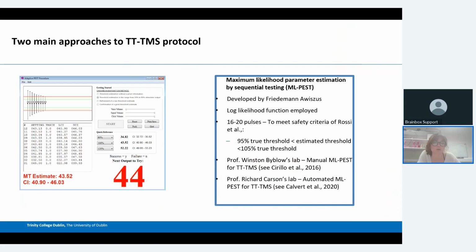I think it's quite comparable to Q-Track, but it's not a nice, refined, easy to use package. It's something I have to tailor for each lab, and so most people would opt for the Q-Track version.